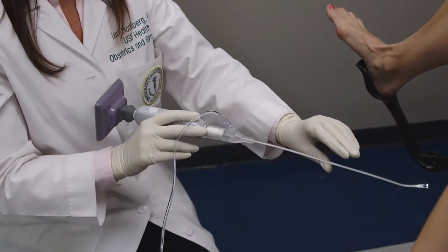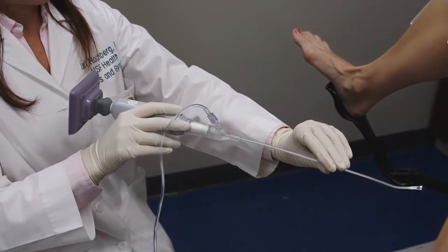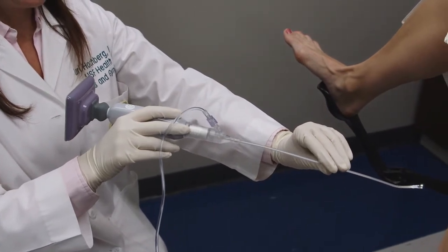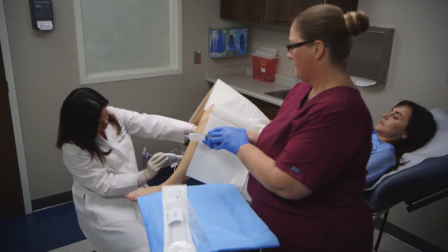If you have difficulty maneuvering EndoSea due to a tight cervical canal, it is helpful to use your non-dominant hand to hold the cannula near the vaginal introitus to help rotate the device and guide it in.